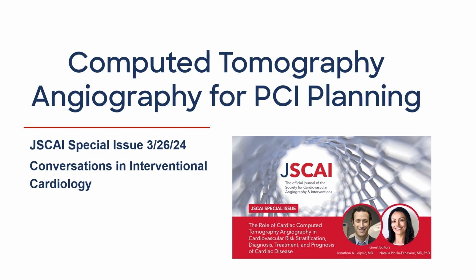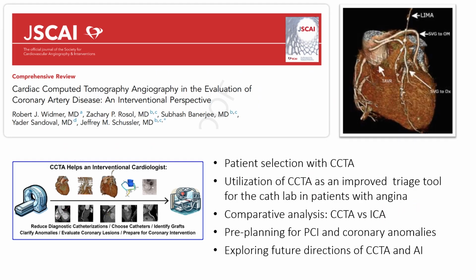We actually published one of the lead articles in it, and this is sort of a comprehensive review. And as opposed to the primary care version, this is really how do we use this in the cath lab? And we actually can take those images and plan for our procedures. We can say, hey, not only do I think you need a heart cath, but I think you're going to need this long of a stent. We think that we're going to have difficulty in these areas because of the type of plaque that you have. We think we're going to have to use these tools, and you can get a lot of insight into what your procedure is going to be like even before they ever get to the cath lab.